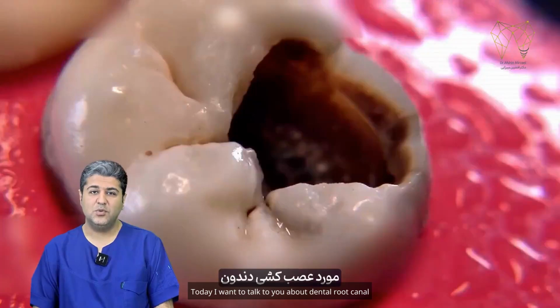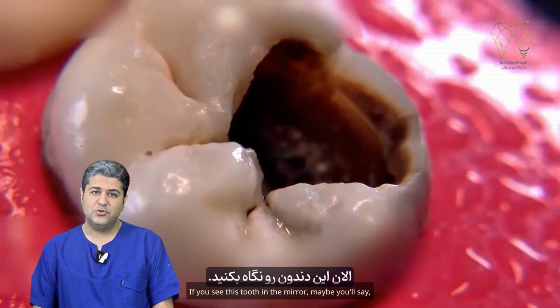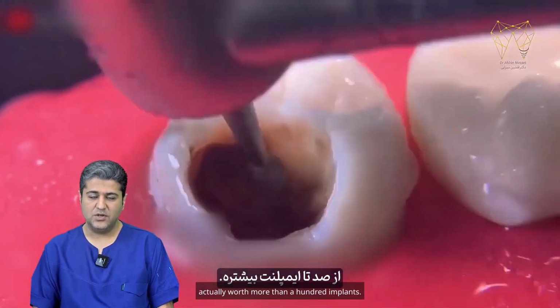Today I want to talk to you about dental root canal treatment and its different stages in the procedure. Now look at this tooth. If you see this tooth in the mirror, maybe you'll say, I want to go and have the tooth pulled. But remember this important point, a decayed tooth is actually worth more than 100 implants.